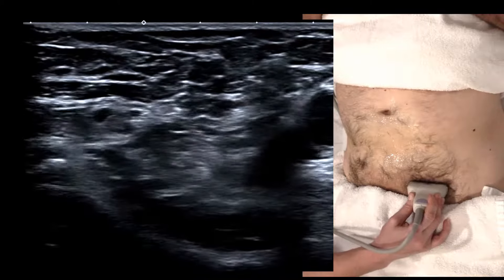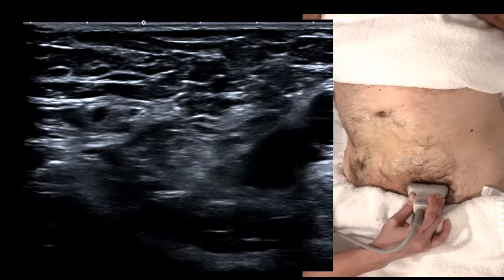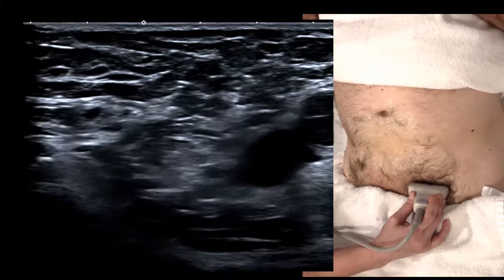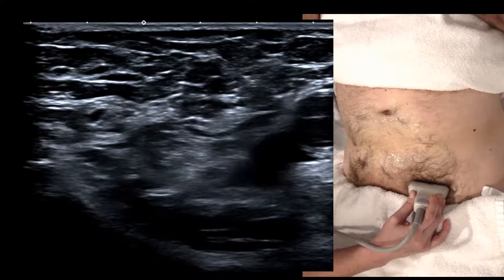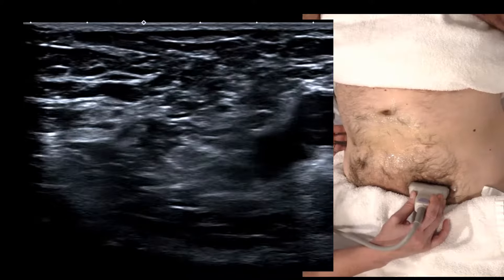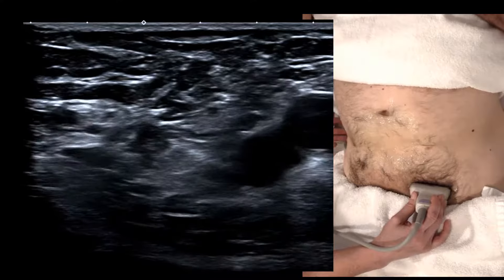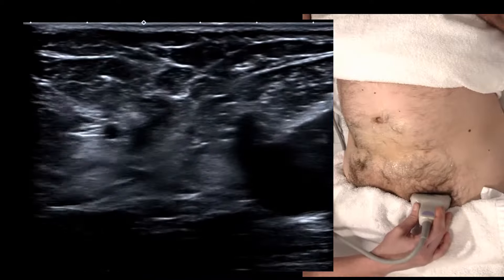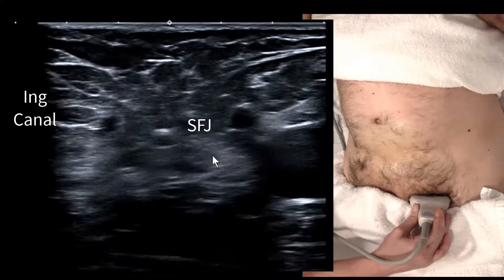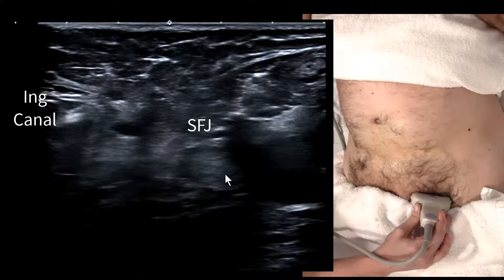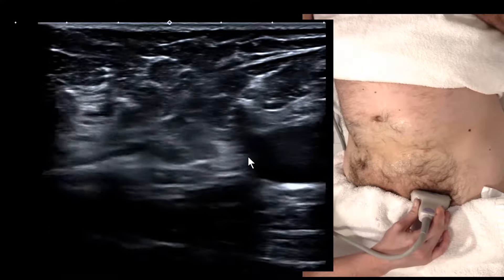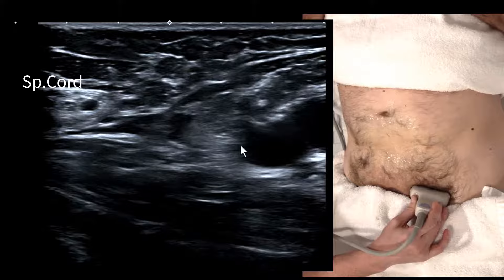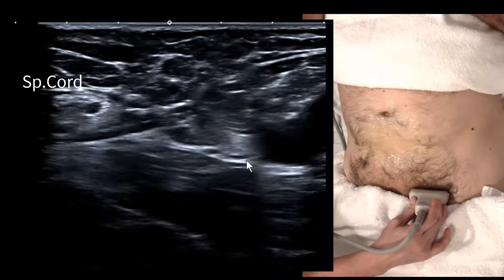This is the point where we ask the patient to Valsalva — hold their nose, blow into their cheeks, distend the abdomen — just make sure you don't see the hips lift off the table. Take a big breath, hold your nose, blow into your cheeks — you can see there's no movement in this region, so no femoral canal hernia. Check your position: if you're just adjacent and above the SFJ, you're in a good position to diagnose one.